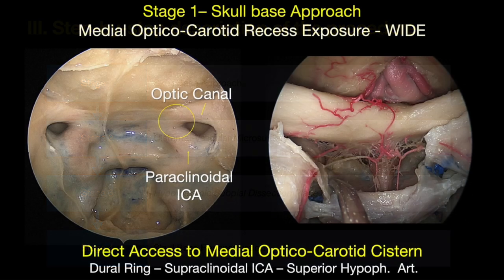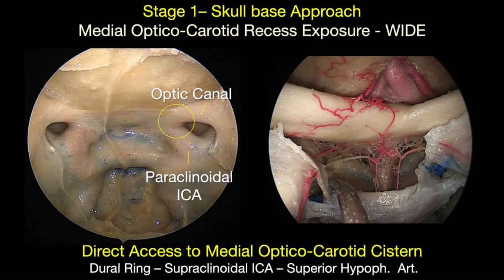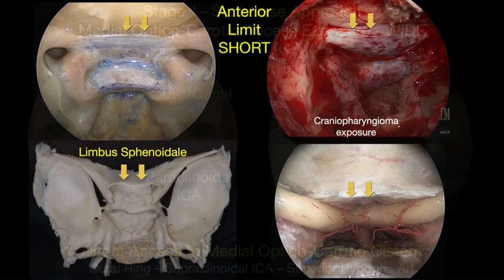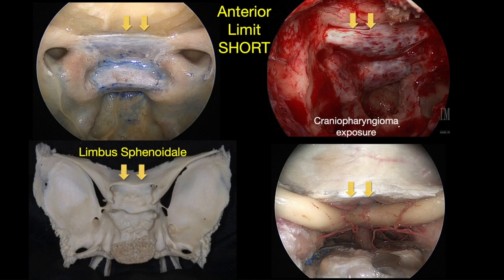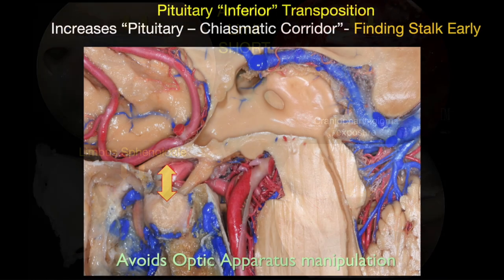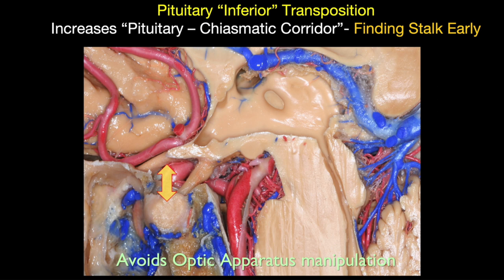On stage one, it's key to perform a wide exposure all the way to the medial optico-carotid recess, but not too far — it is short, limited by the limbus of the sphenoid. The exposure includes drilling the floor of the sella to facilitate mobilization of the pituitary gland inferiorly as needed.